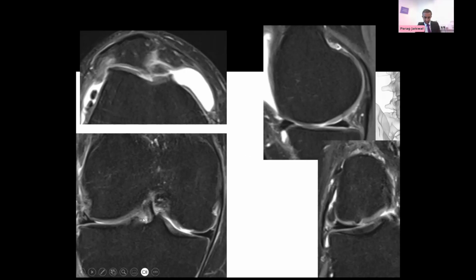This is the coronal views, and you can see here cartilage is lining nicely this compartment. It's nice and gray, but here there's a full thickness defect. There's a little tear in the meniscus here. This is a side view, again, with a big loose body or osteochondral defect here. So his knee was not good.